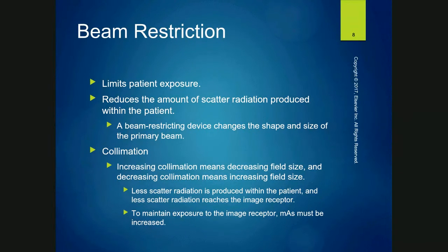Also, the way that works is because, yes, you're making the same number of photons, but the collimator shutters that you guys are moving when you're turning those knobs on your collimator box are lead. So they are getting in the way and stopping those photons from passing through the collimator box. So that's how that works.